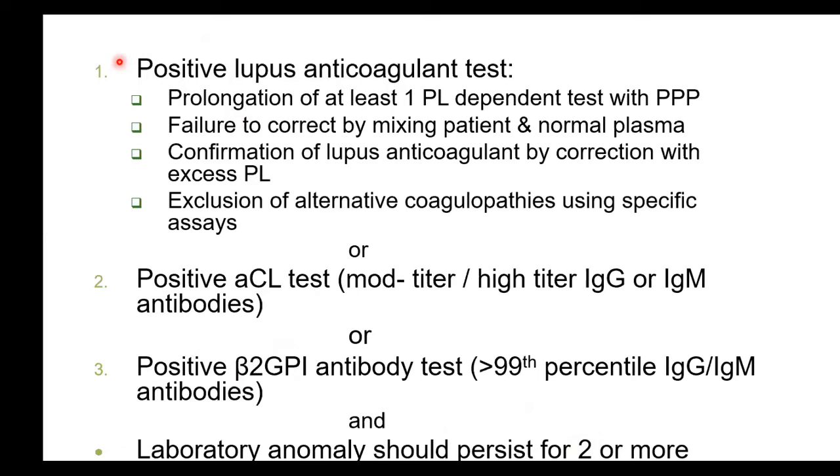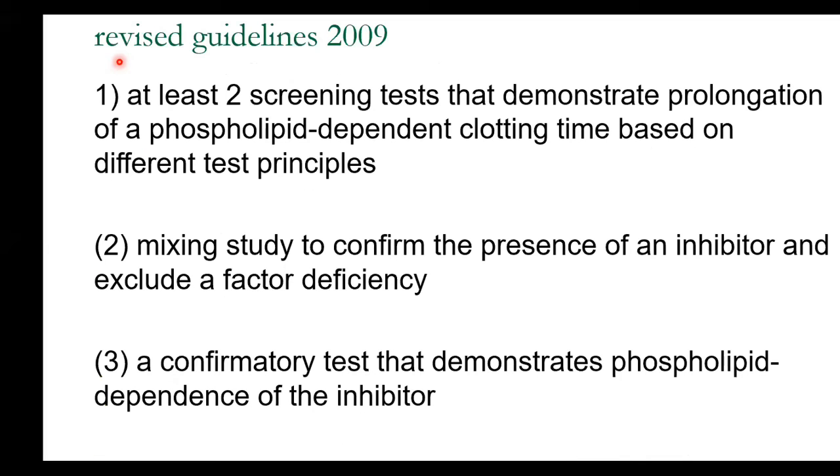I will be briefly discussing with you how you do the lupus anticoagulant test, because any lab which is dealing with a sufficiently high number of cases coming from gynae, medicine, or derma gets LA testing as a very common referral. So we should know when we call lupus anticoagulant as present.